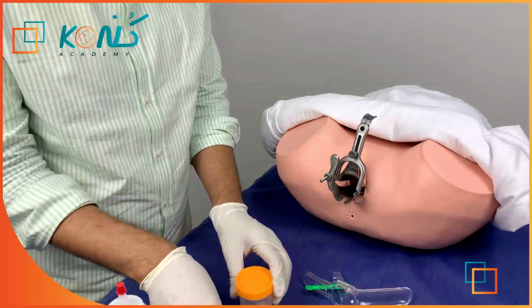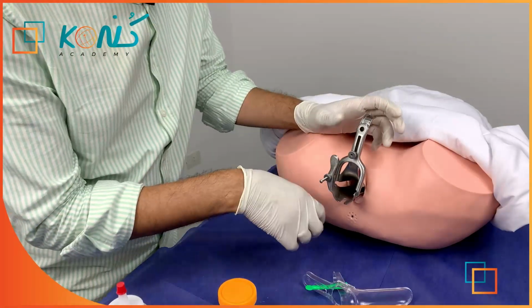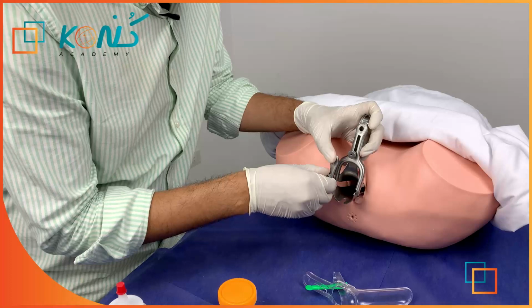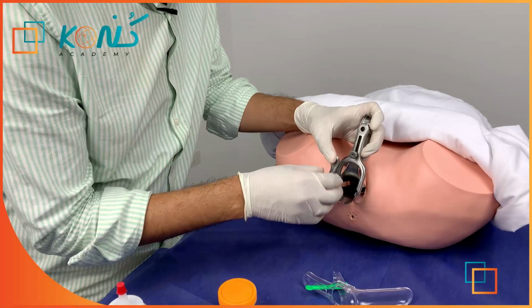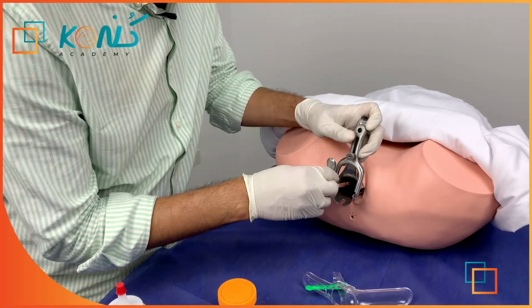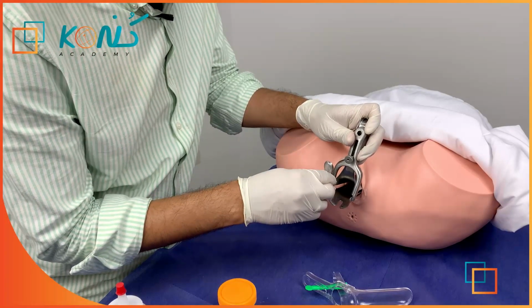After taking the sample, it is almost done. We have finished taking our sample and examinations. I will take the speculum out. You will take it slightly out, and you will not close it. Take it slightly out. I didn't close it right now.